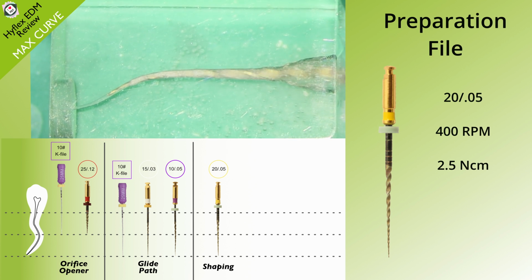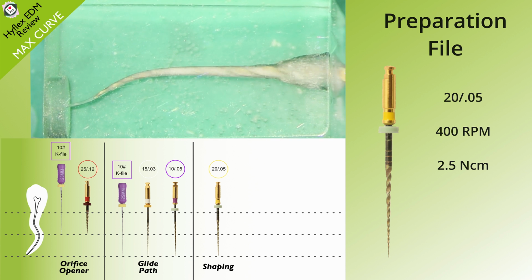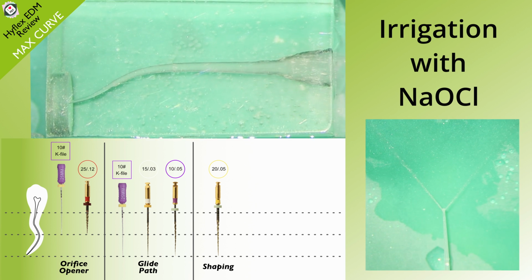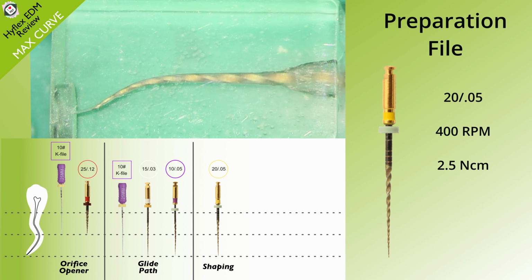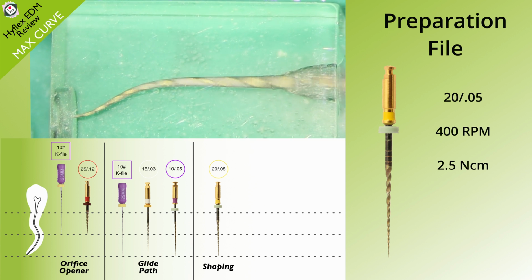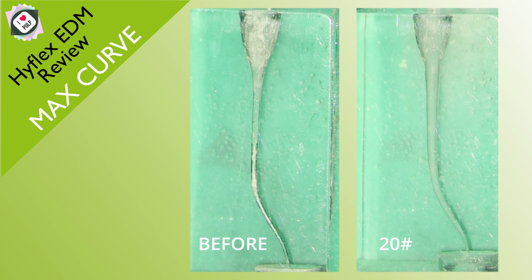So on the first pass using the size 20 prep file, we didn't get to length, and it's really important that you don't force these files, because obviously you can cause file fractures, and also you can cause ledges or transportation. More recapitulation with the size 10K file. And more final shaping with the size 20.05 Hyflex file. And irrigation. And again, we compare the two preps, and it looks gorgeous, really minimal, all the debris out, looks fantastic.